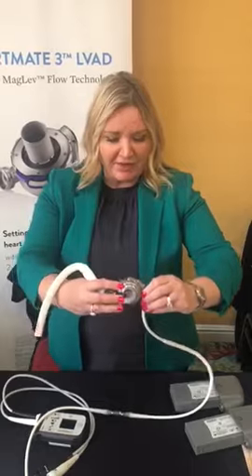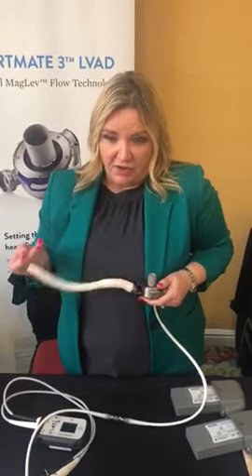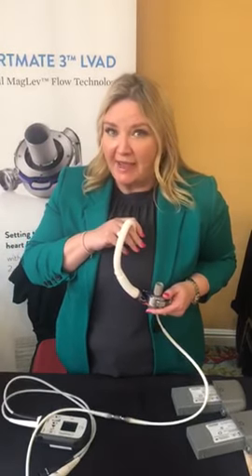Look how small this is. Basically what they'll do is it's completely implantable — they'll cannulate the apex of the left ventricle and then cannulate the aorta to completely bypass the LV in patients who are waiting for a heart transplant or they might use it for destination therapy.